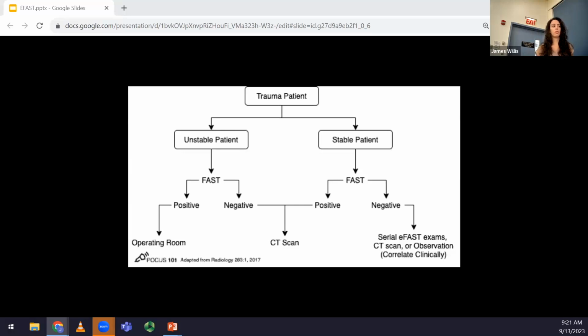It's very helpful for our surgeons if they're able to get a CAT scan that shows that the patient has a liver laceration causing their injury, rather than taking them blindly to the OR to do a full laparotomy and search every organ for the source of the bleeding.